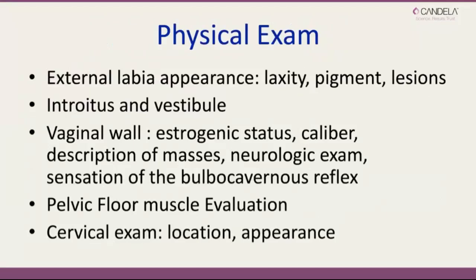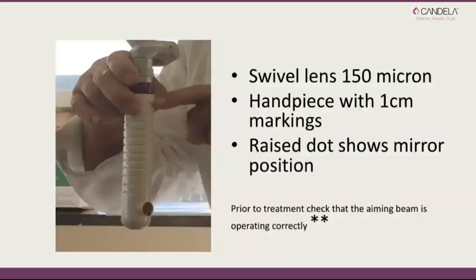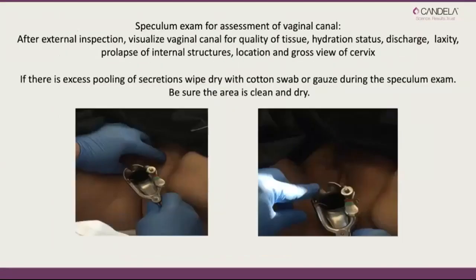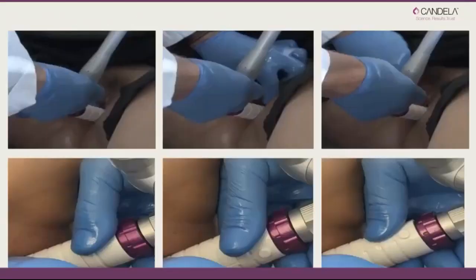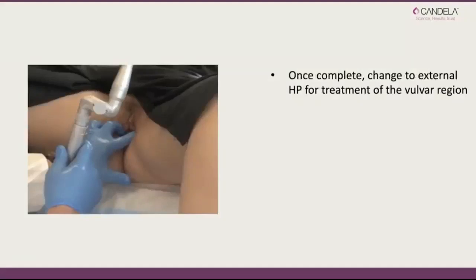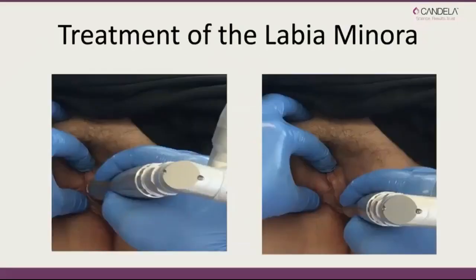your Candela specialist. But one thing I'll just emphasize is that if we are doing the core intima treatment, I always insist the patients have a GYN, a gynecological evaluation with up-to-date pap smear before they come to me for the treatment. And I think that's the last point that I will make. This is just showing you the treatment which I described to you already and the internal placement. And just to be pulsing around the clock, and we can customize again. This is a very individualizable treatment.